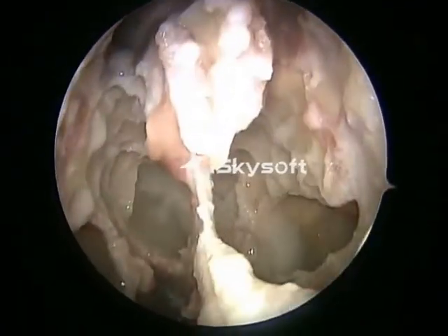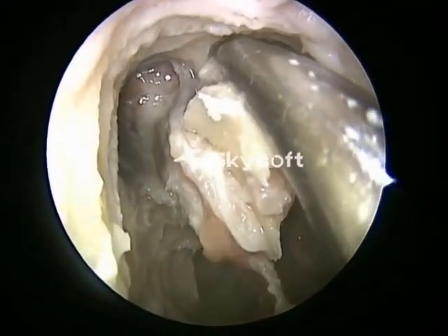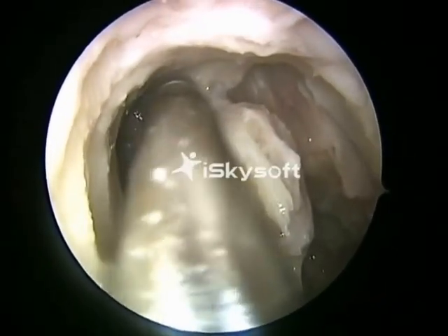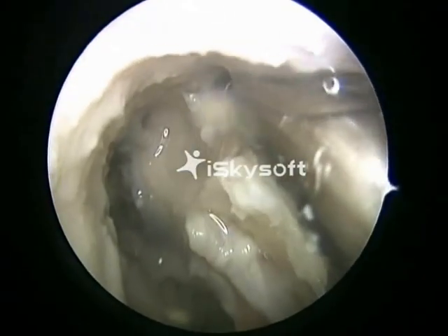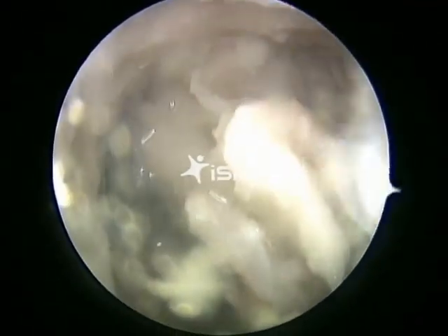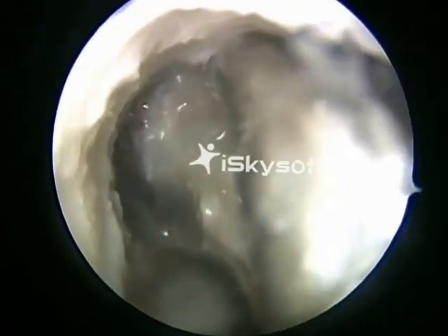Here, we are showing this procedure as the first part of a transcribriform approach. You can now see the frontal sinus on both sides have been connected. The interfrontal septum is being drilled away now. This can be compared to the facial ridge in modified radical mastoidectomy, and care is taken to reduce the interfrontal septum flush with the posterior table of the frontal sinus, so that an oval looking cavity is created.